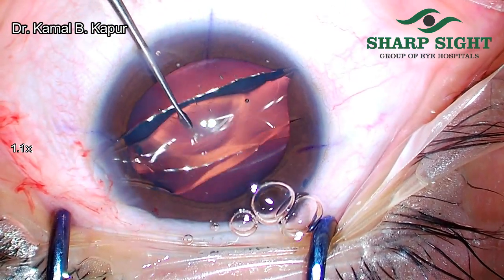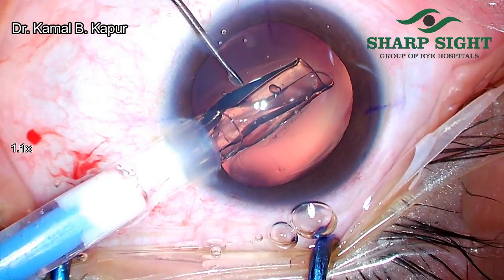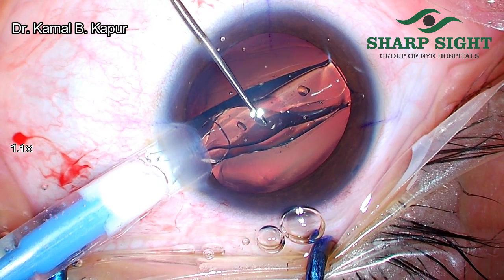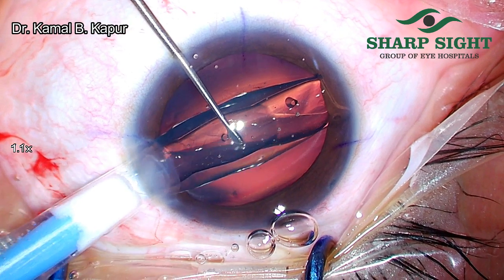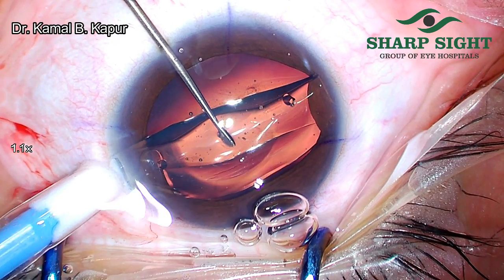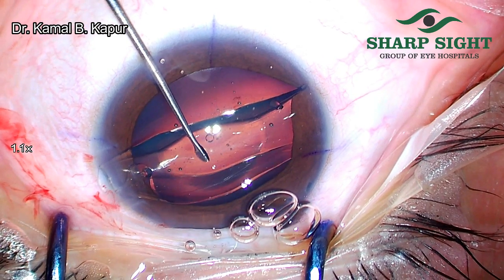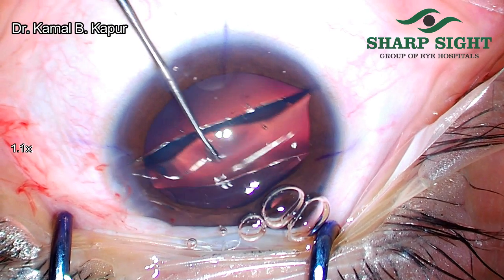Make sure that the ICL doesn't open completely and make sure it doesn't hit the endothelium. Let's see it in slow motion. As the lens is opening, the instrument from the left side is going to stop the lens from opening completely vertically and hitting the endothelium, making sure that the ICL doesn't open upside down. The left hand stabilizes the ICL from opening completely and stops it from touching the inner part of the cornea.